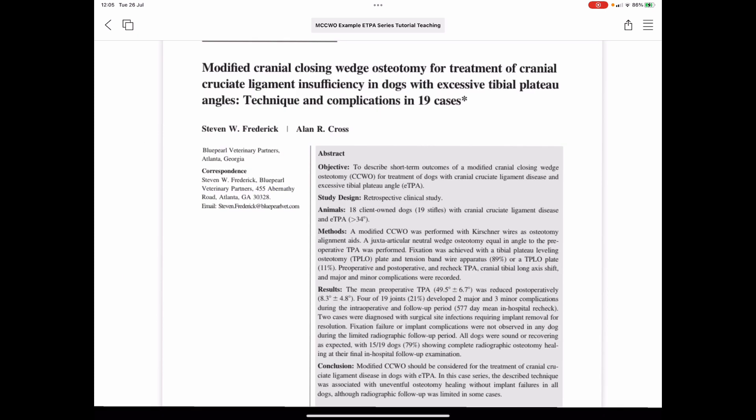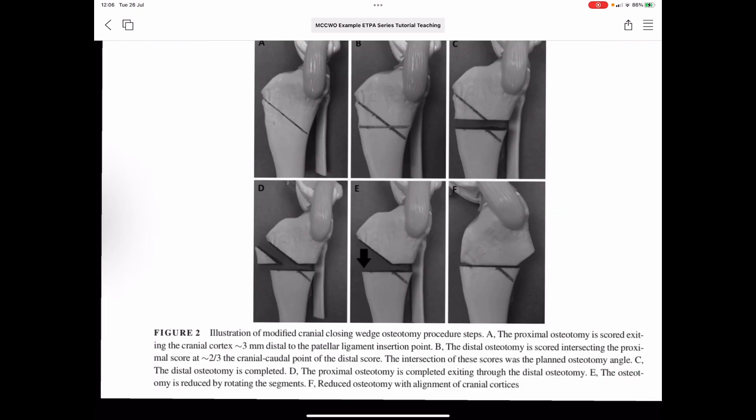Thanks to Frederick and Cross's 2016 paper — and thank you to Dr. Cross for allowing us to make direct reference to it here — we know we can take a modified wedge technique to level those stifles with eTPA. Essentially, we're going to be taking an asymmetric wedge to level an eTPA but also minimize the loss in tibial length associated with wedge techniques.